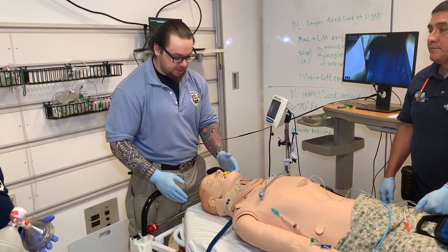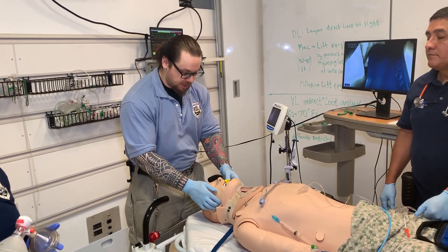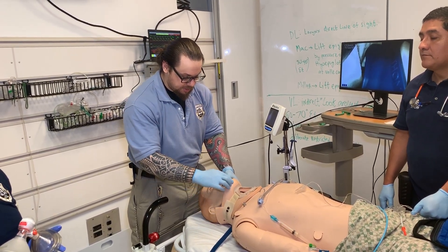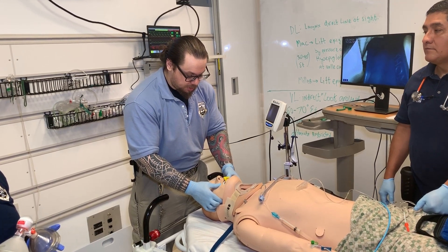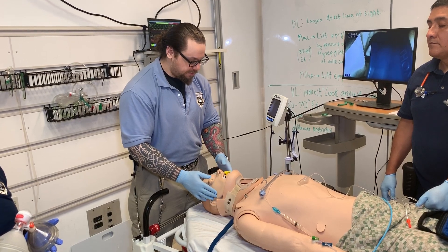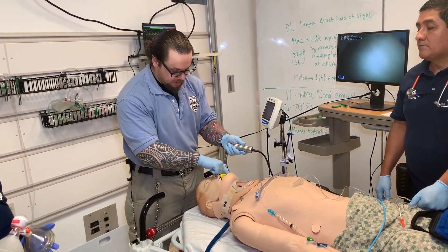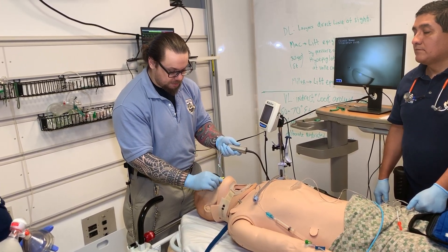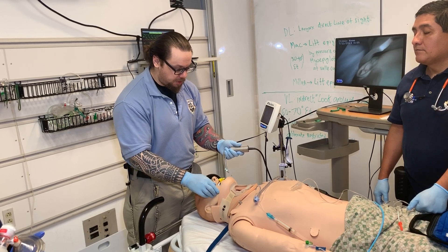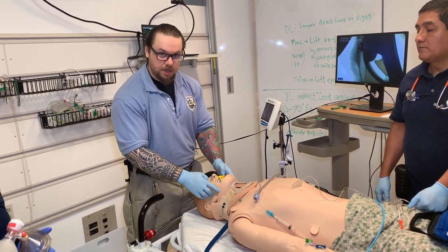The problem is that if I want to employ basic life support procedures such as a jaw thrust, the C-collar is not allowing me to do a good mandible displacement in order to conduct a proper jaw thrust. More importantly, if I want to instrument the airway with my blade, this cervical collar would not allow me to displace the mandible. So for us to intubate and have the best view of the vocal cords, the cervical collar has to come out.